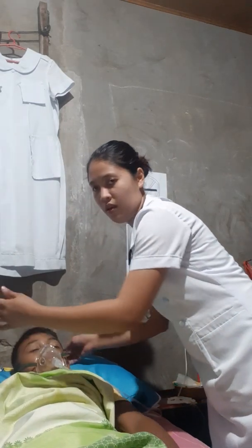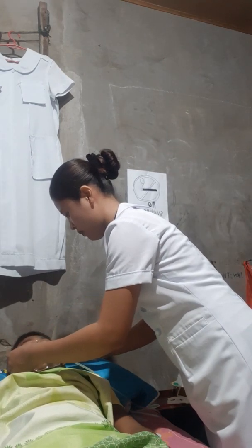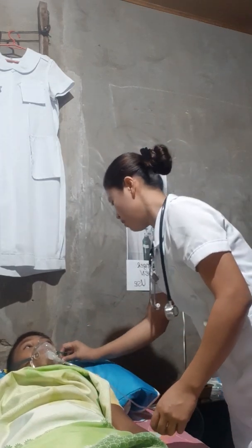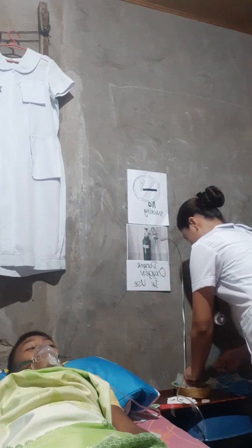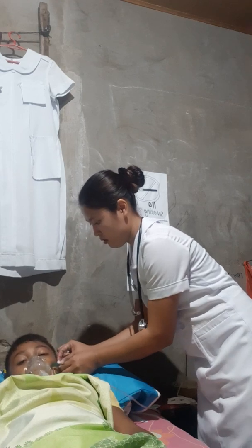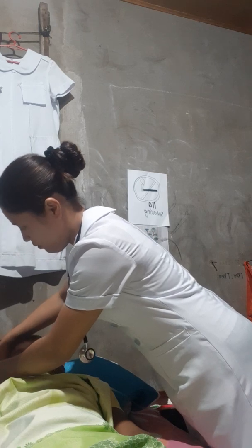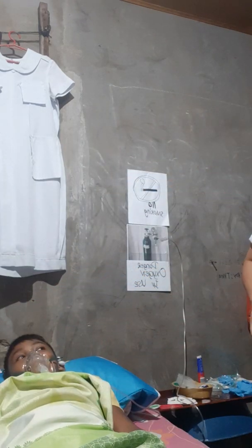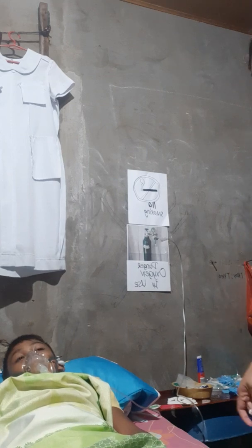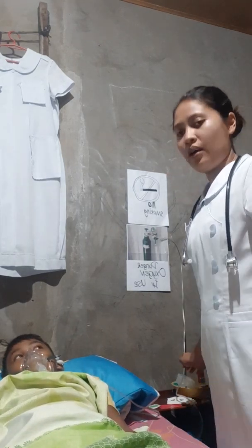Then the rubber band should be behind the head of the client. If it's not comfortable, then place some padding on each ear to prevent irritation. Afterwards, encourage the client to breathe through the nose while the mouth is closed.